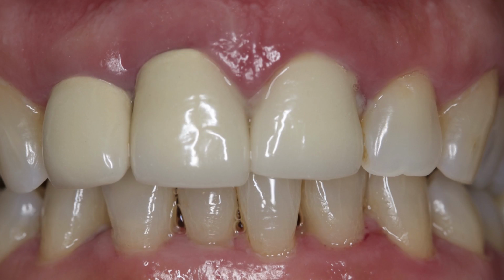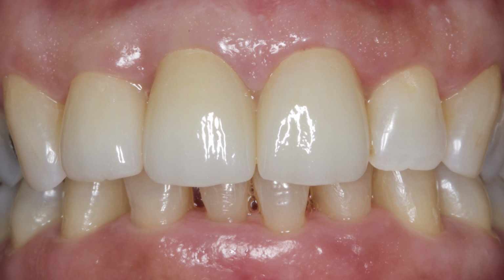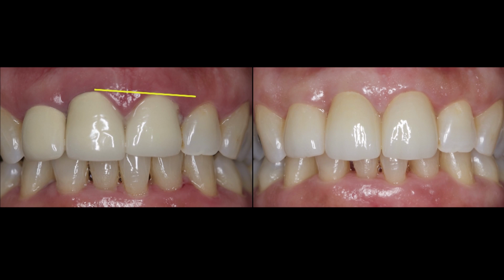Pre-op, we noted how the health of the soft tissue affected the appearance of 8 and 9, predetermining a slight change in gingival architecture of number 9, especially in a high smile line patient like in this case. We can see post-cementation how the trend of the soft tissue is characterized by an ideal symmetry. There is a correct parallelism of the gingival line and the incisal edge position.